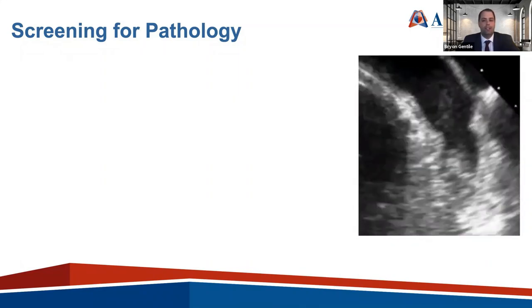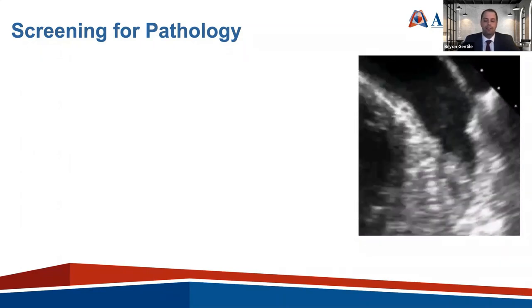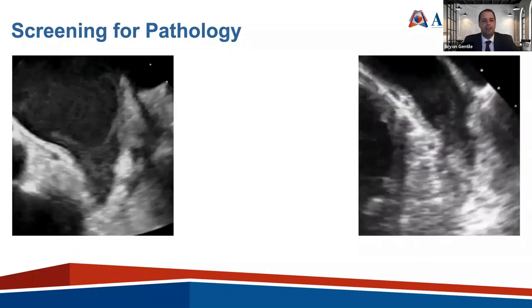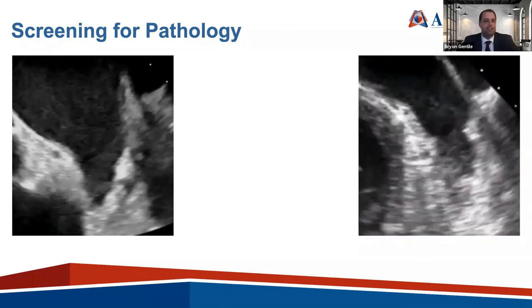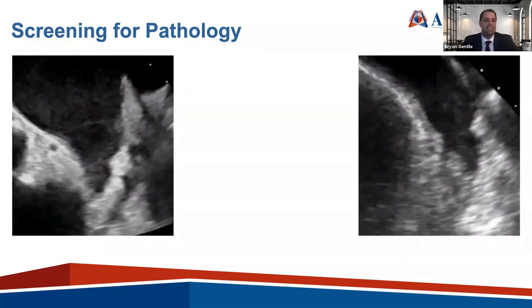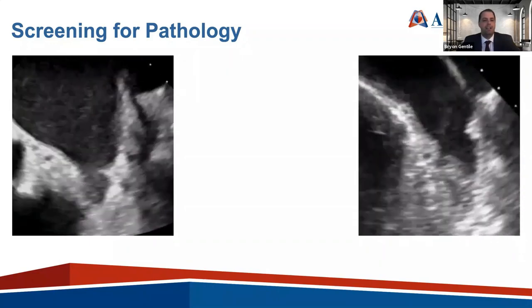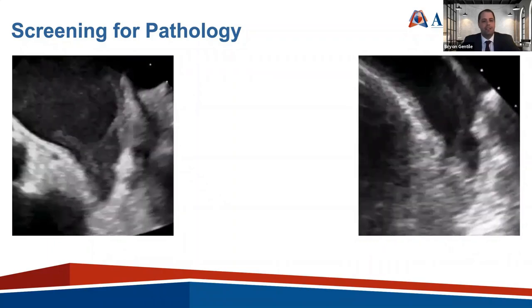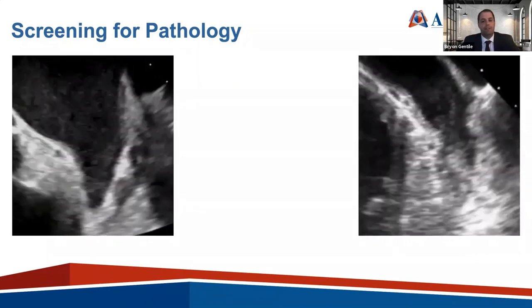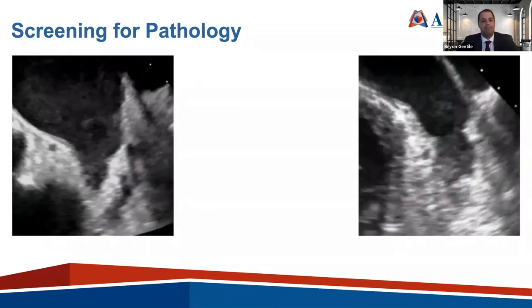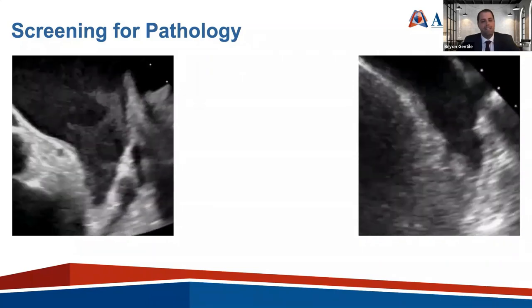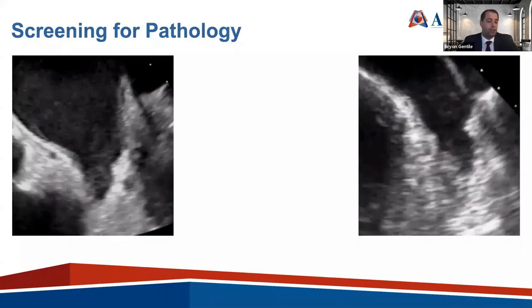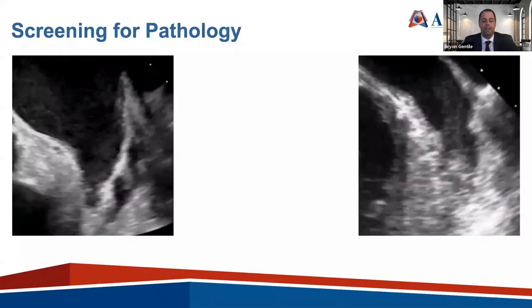We would treat this patient with oral anticoagulation, bring them back for closure, and we've done that successfully on many occasions. On the other end of the spectrum, this is smoke — spontaneous echo contrast — seen in the body of the left atrial appendage and throughout the left atrium. There is an increased risk of thromboembolic events compared to a matched group, but in general these patients can have their appendages occluded or cardioverted without increased risk of events.